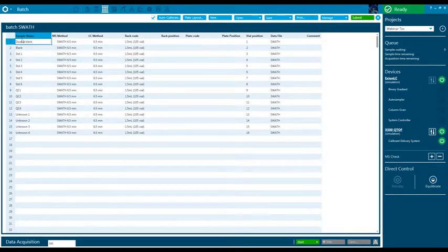Here is an already filled batch. We can use, save, modify as you want, and submit it in the queue. Of course, you can activate the auto-calibration, allowing to calibrate every 5 or 10 samples, thanks to the CDS, to maintain the accuracy at 1 ppm maximum.